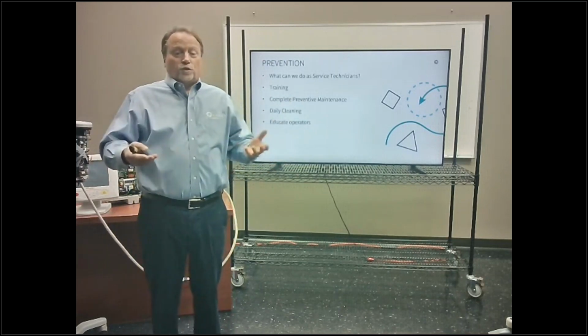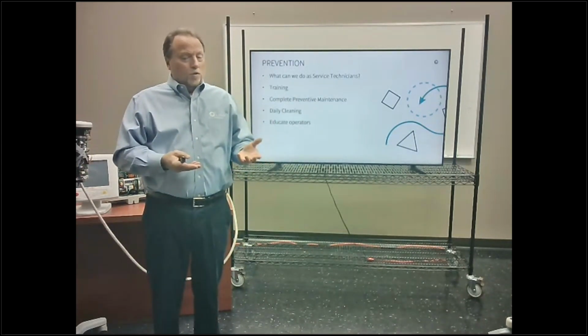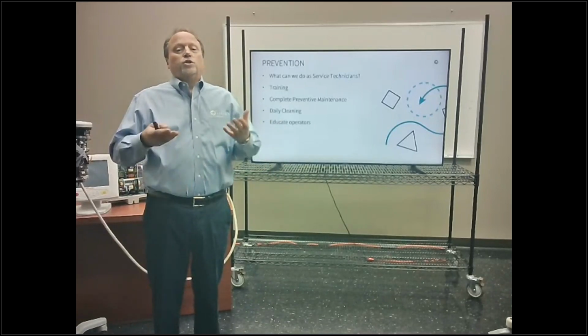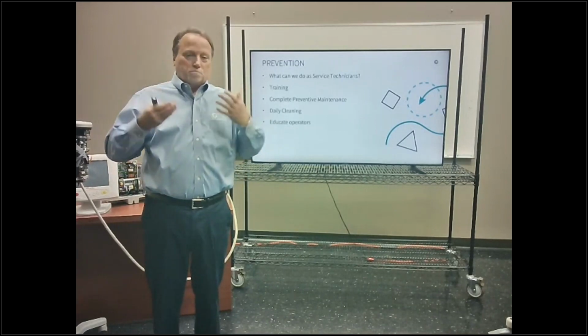Do you change your oil filter every time you change your oil? Usually, yes. Does the oil filter look bad? Well, no, but you do it anyways, right? Same thing. Do a good preventive maintenance on it, and your service calls will drop dramatically.